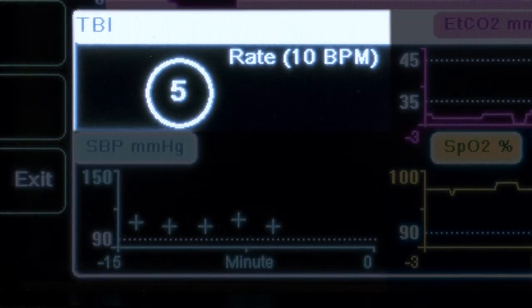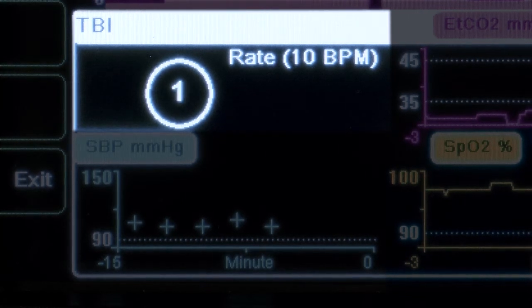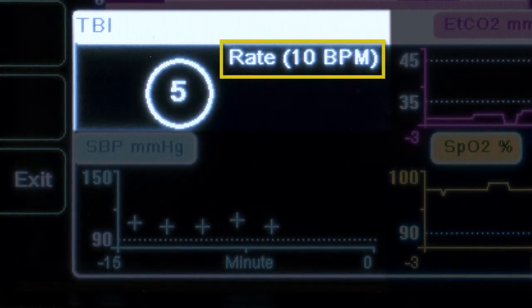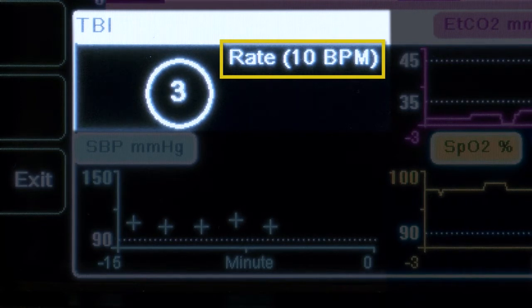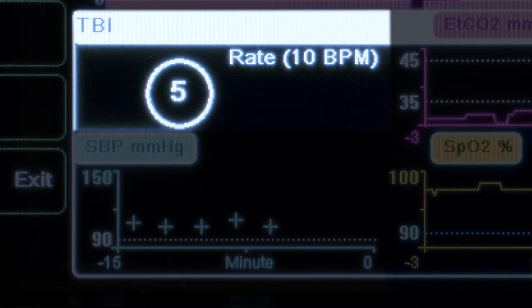The simple ventilation timer is a countdown timer only and will not provide any ventilation feedback. When in adult mode, the default ventilation rate, measured in breaths per minute, will be 10. This is configurable in the supervisor menu.